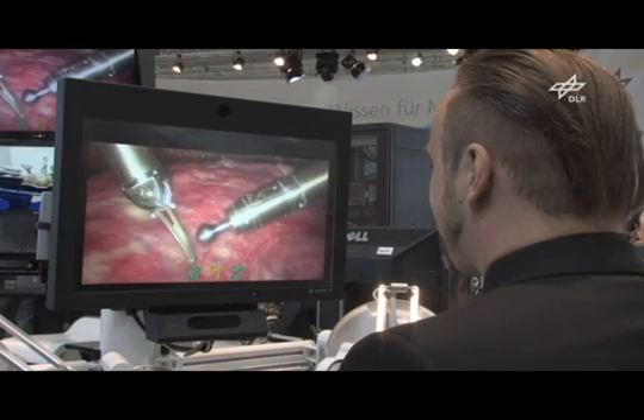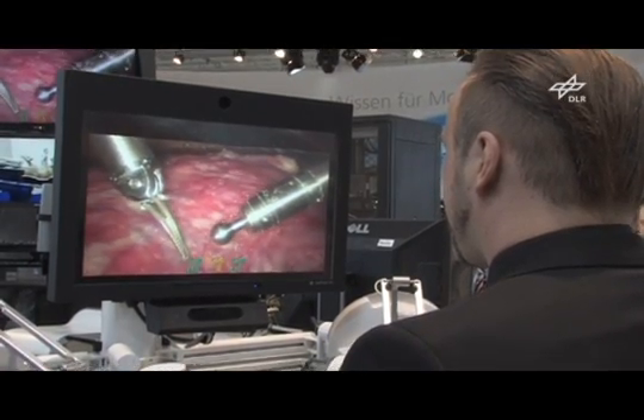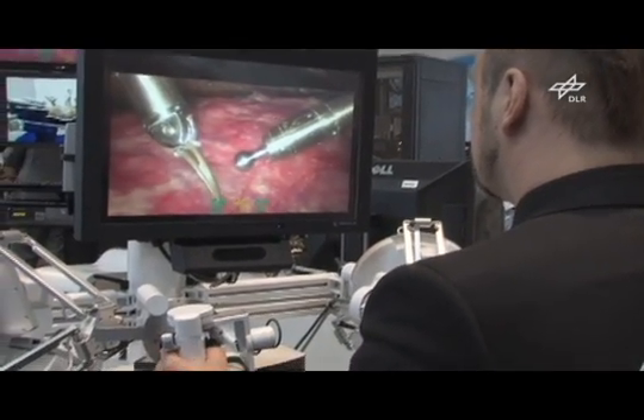The inside view of the patient is displayed to the surgeon on a stereo display. An autostereoscopic display is used here, so that no additional glasses are required to get a stereo impression.